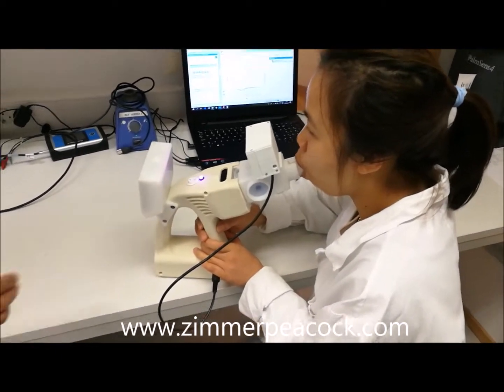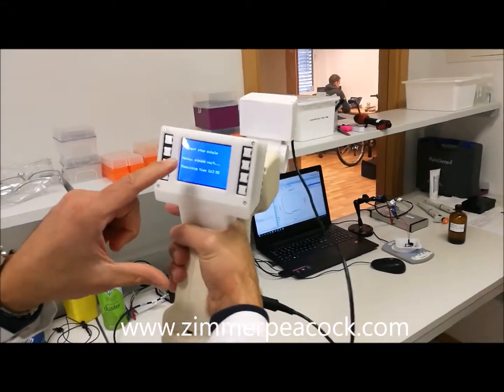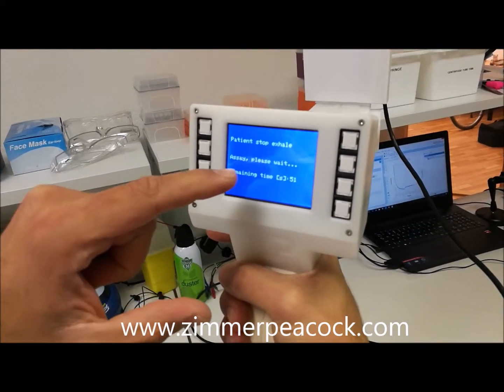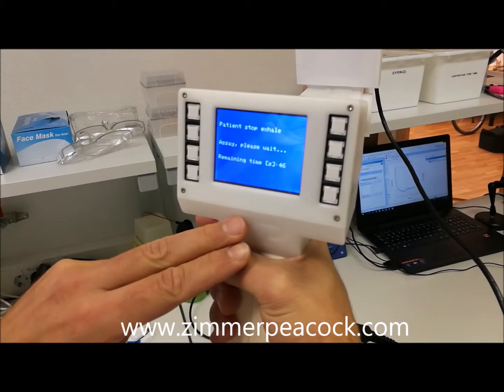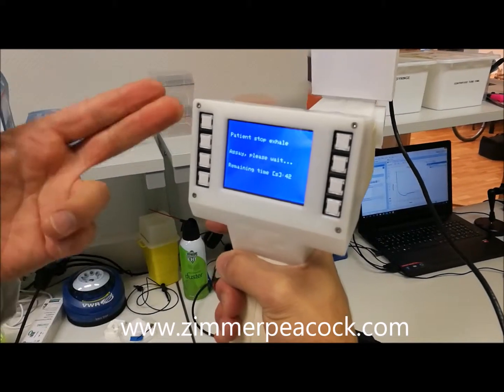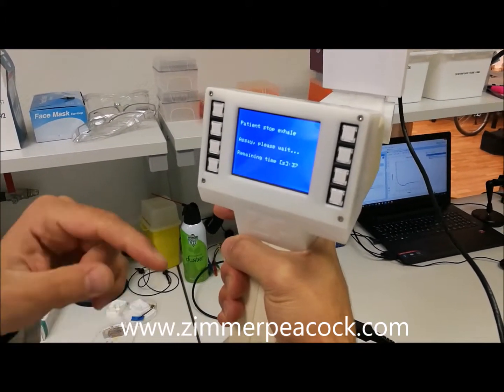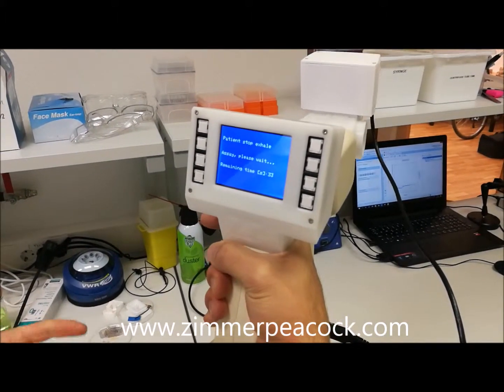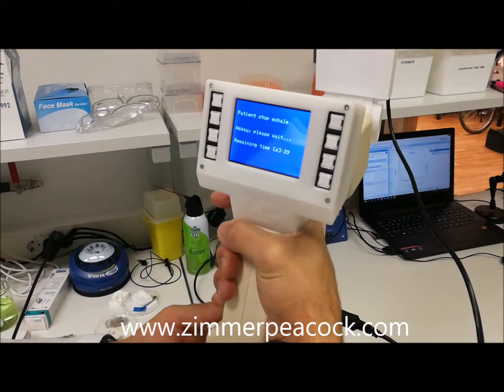In this case it's set to breathe for about one minute — there are five seconds remaining now. A different light comes on and the patient can stop exhaling. It then runs the assay and shows the remaining time.